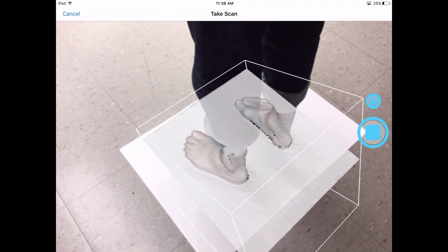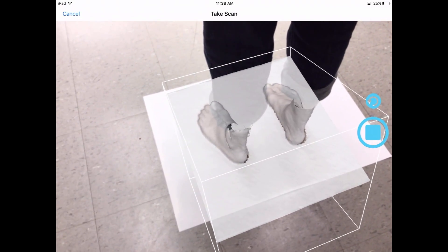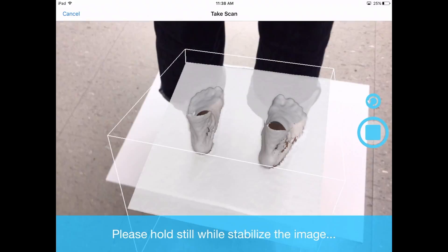You can get image separation if you're on streaky backgrounds or there's glare on the floor. What we did here was simply lay down a plain sheet of paper. It doesn't matter the color, but it helps make for a smoother scan.